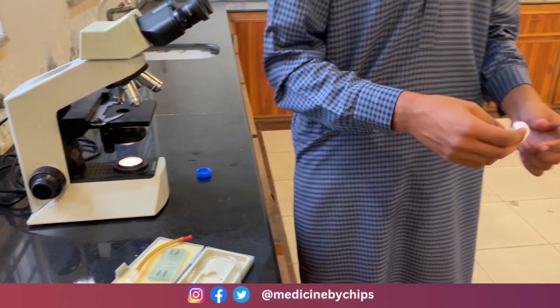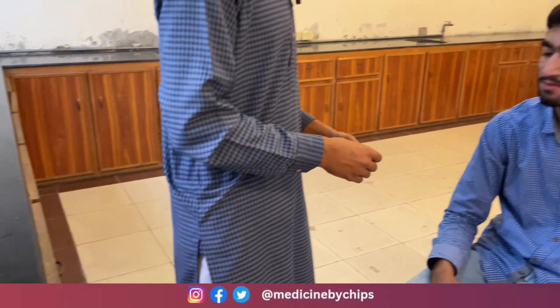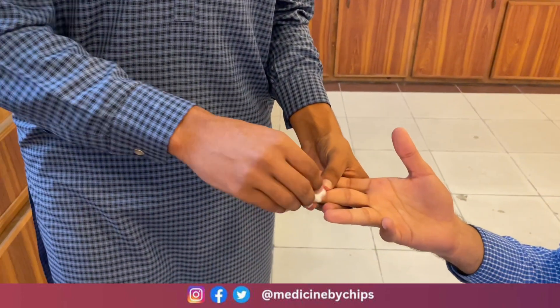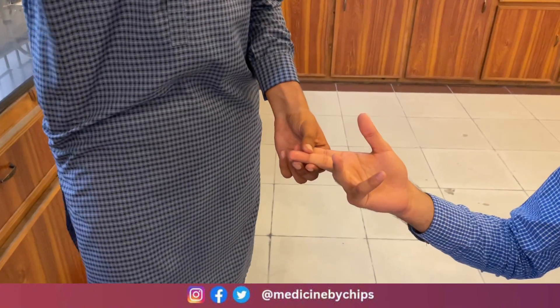We will take the blood of the patient. First of all, we take the consent of the patient. We will take the middle finger and sterilize it with cotton gauze.